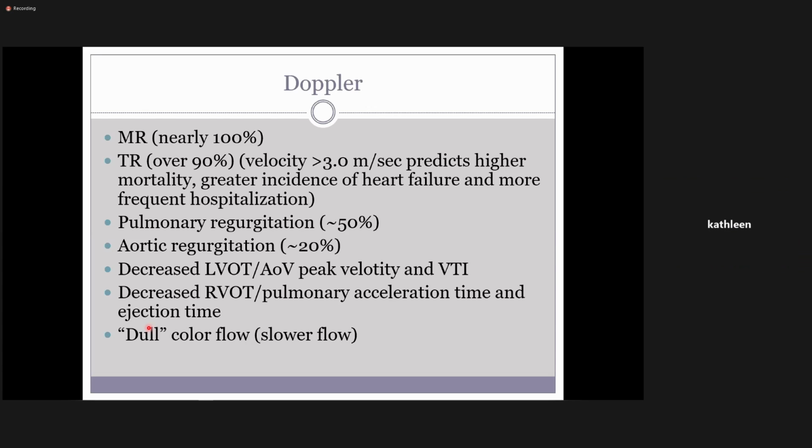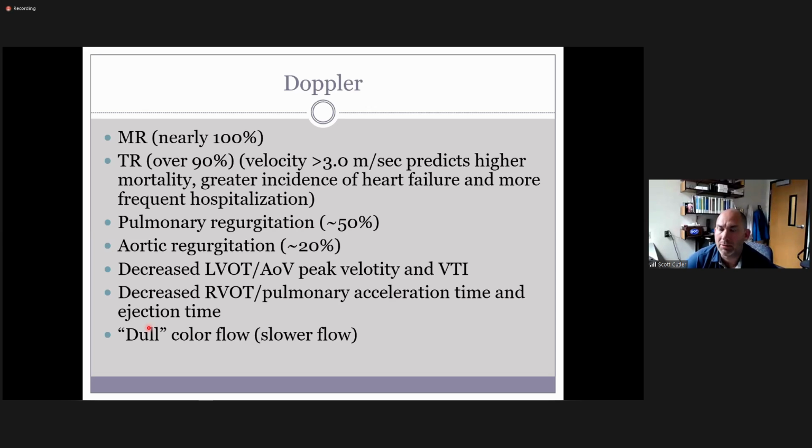Hi, Scott. Just following Nancy's question, on the opposite of that, what would you leave out of that exam? I'm not going to focus as much on, if I'm going just after dilated cardiomyopathy, definitely coming out with the EF, definitely coming out with diastolic function, definitely showing all the chambers and their sizes.